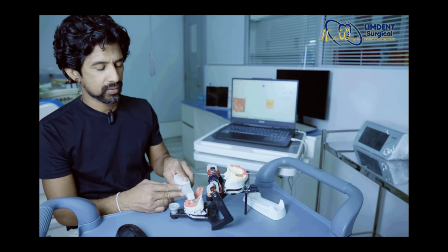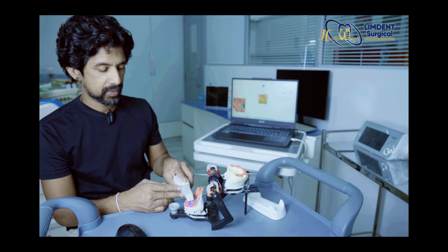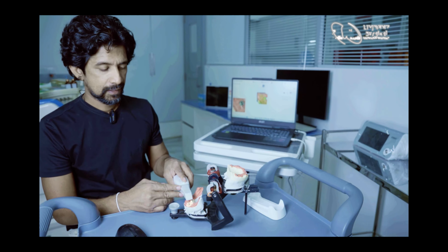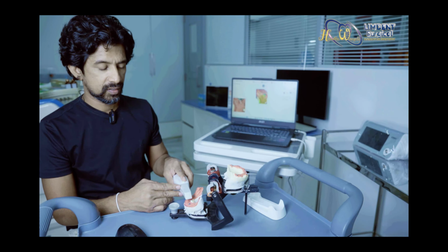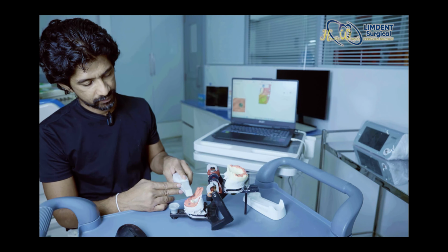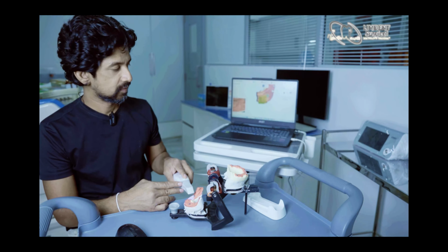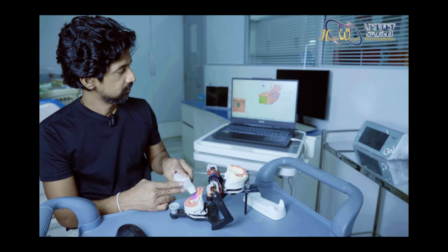One thing is very important: when you're going to record the lower cast and the upper cast with the impression, the soft tissue material should be arranged on the cast for the scanner to be sensitive enough to collect the whole data.